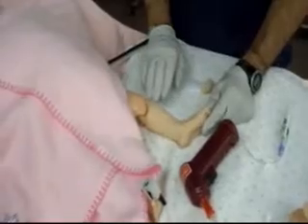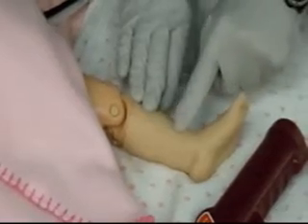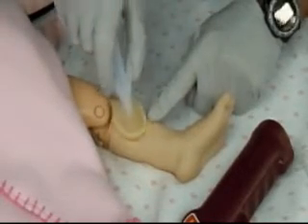On the pediatric patient, we're going to find the patella, go 2 finger widths below the patella, and feel for the flat side of the bone. We're then going to take our alcohol or chlorhexidine and swab the site.